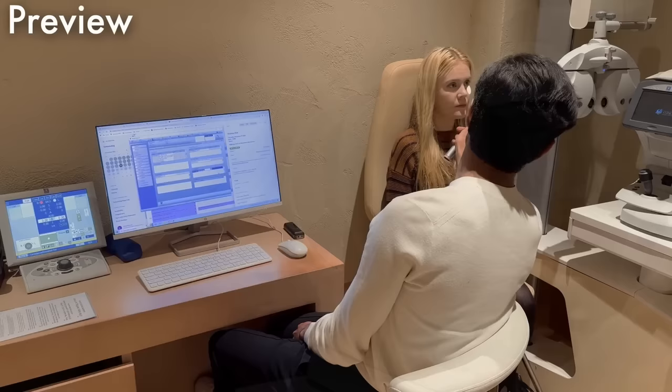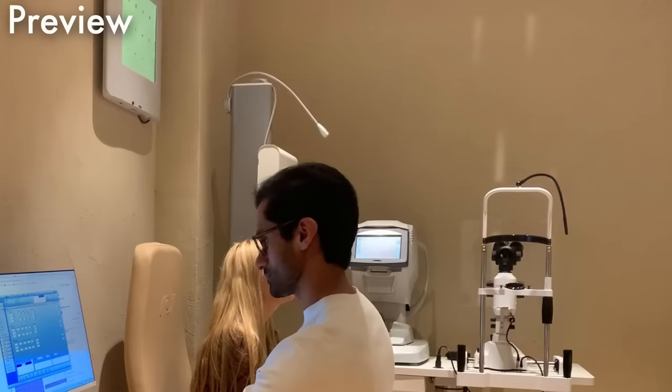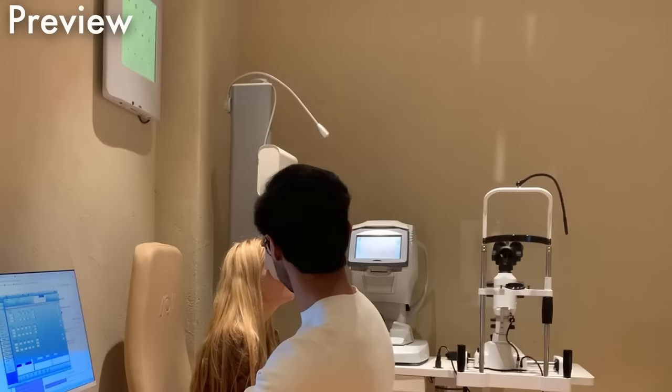Good. Perfect. Try the last line. L C N K. Okay. Now one and two. That's one. And that's two. I think one is better.